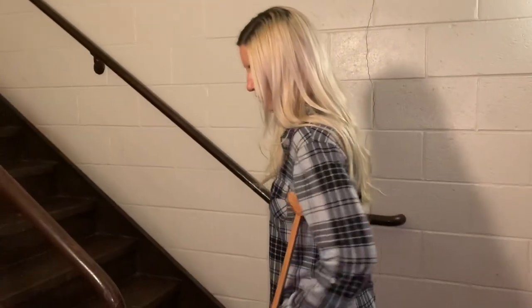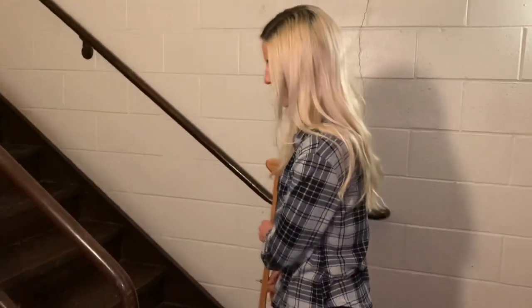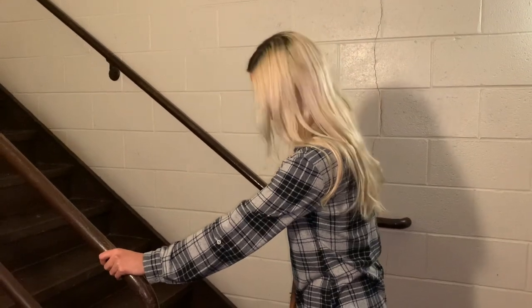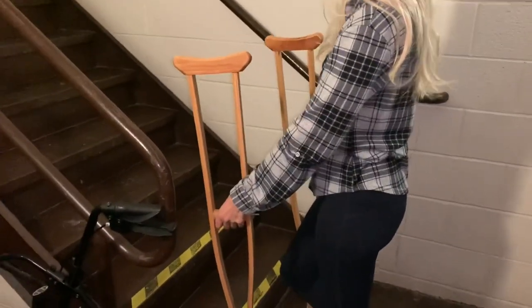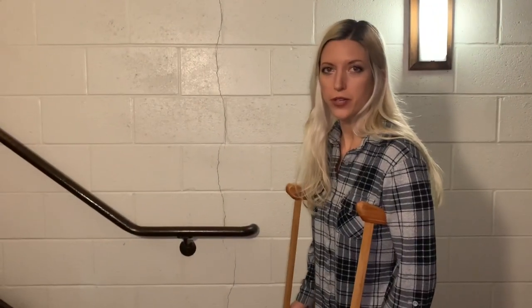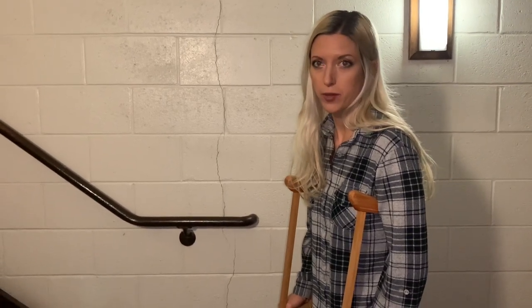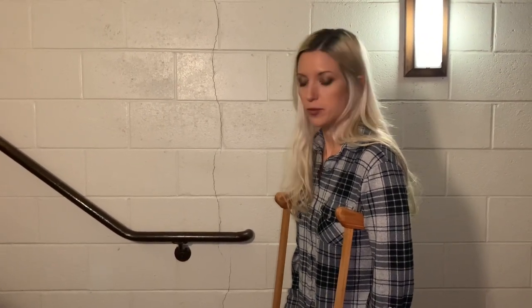Okay, so you're going to bring the crutches over to the injured side, and you're going to support yourself with the rail if you have one. If you don't have a rail, you can go up with the crutches, and I can demonstrate that after. I'm going to show you with the rail. Okay, so stairs are pretty tricky, and you may want to start out with someone helping you because they can be pretty dangerous. So don't even attempt to do stairs by yourself if you don't feel comfortable.